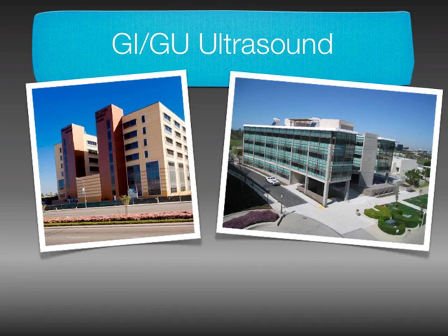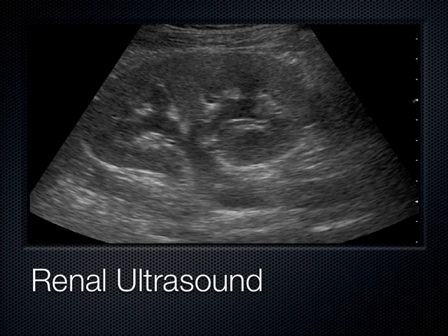So we're going to quickly transition today into the kidney and also some intestinal structures and the gallbladder. So this is the kidney, and you can see it here in all its splendor and glory. But to talk about the different anatomical parts of the kidney, this is the capsule of the kidney out here. Now the capsule is a very rigid structure, and when the kidney expands, it's got nowhere to go, and so it causes the patient a lot of pain if the kidney gets obstructed. For example, when the urine tries to make itself out the ureter, if the ureter is obstructed by a kidney stone, the kidney can't really expand, and so that's what causes such terrible colicky pain.